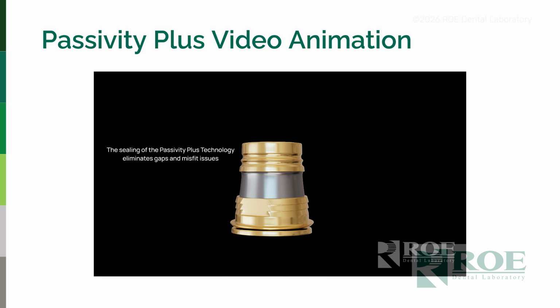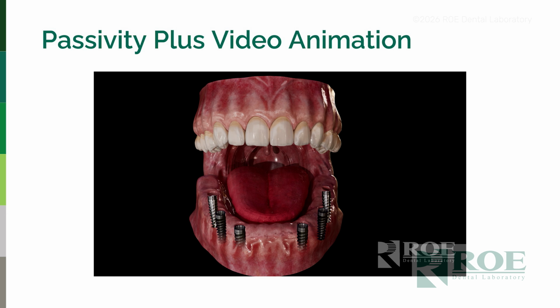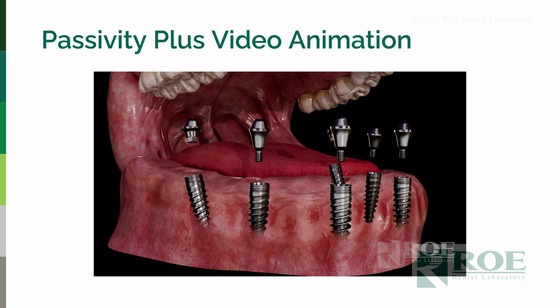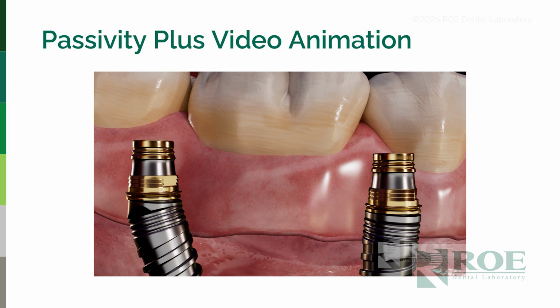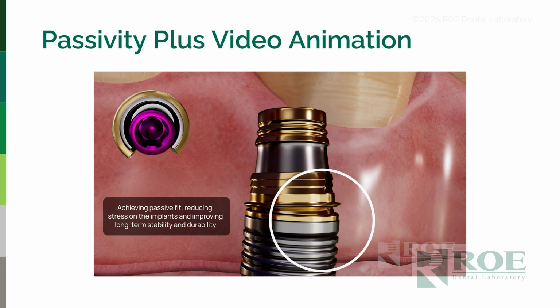So that's the movable bell at the base. Okay, and you can see how the screw will take up any discrepancy as you screw it down, and that's through the ability of the little washer that sits within the tie base. So here the bridge is going on, and here we're going to screw the bridge down, and you'll see the bell is movable.